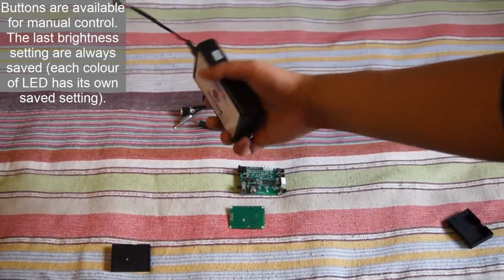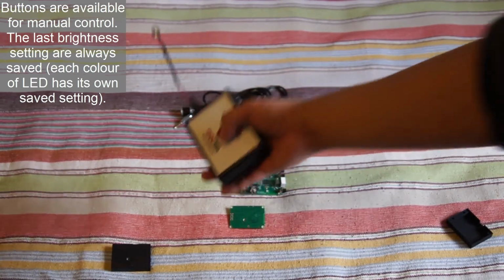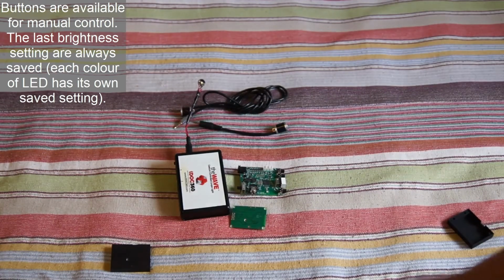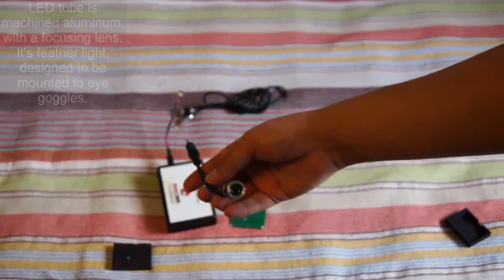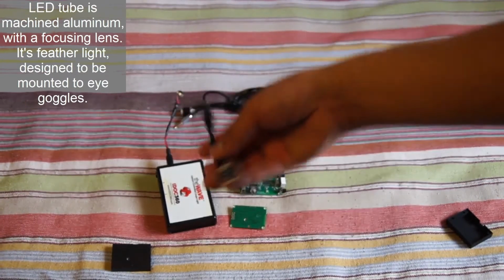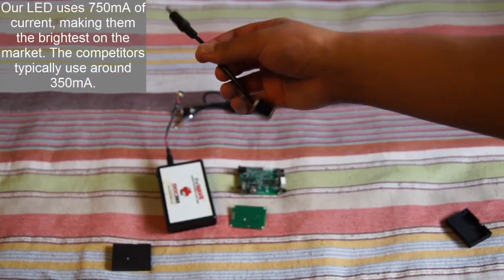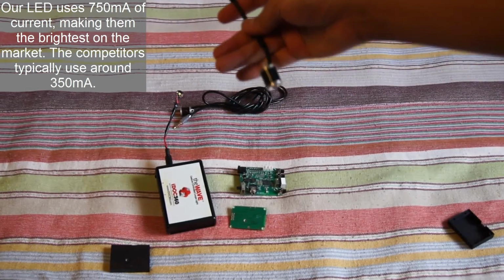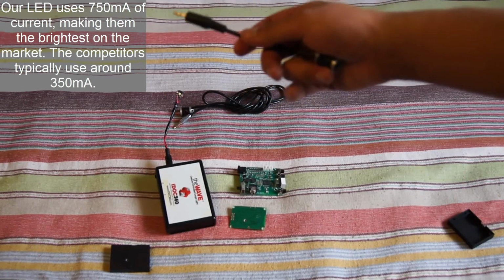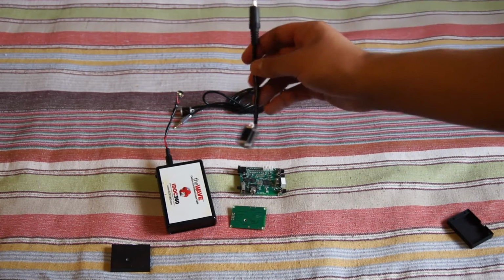The buttons here are manual controls, just in case you don't want to use the wireless. The brightness will always be remembered, so it remembers the last setting you put it on. The LED here is an aluminum tube that has a lens. The LED is getting 700 milliamps worth of current, and it's one of the brightest on the market. From my research, most of the other lights use 350 milliamps, but iDOC360 insisted on the brightest LED.